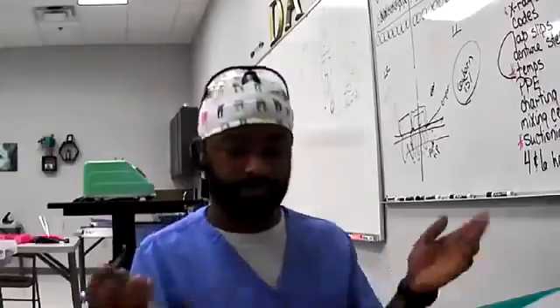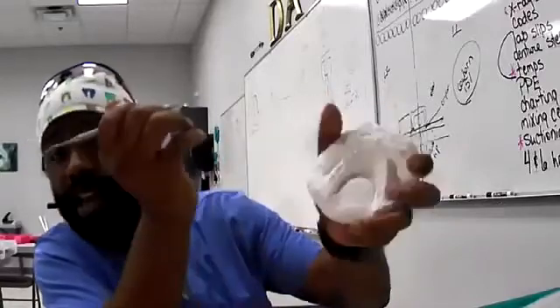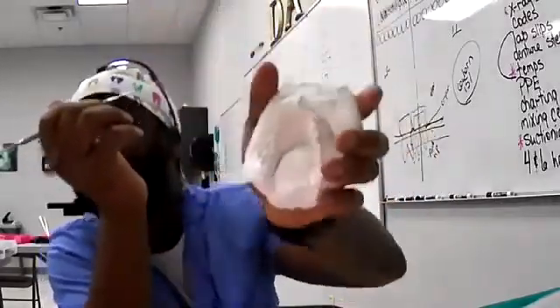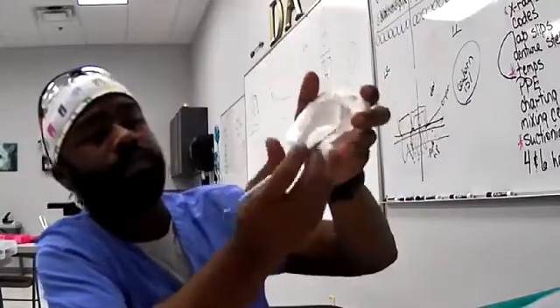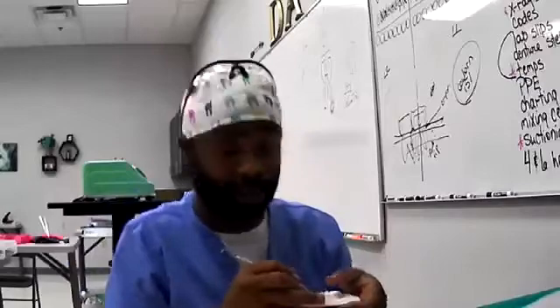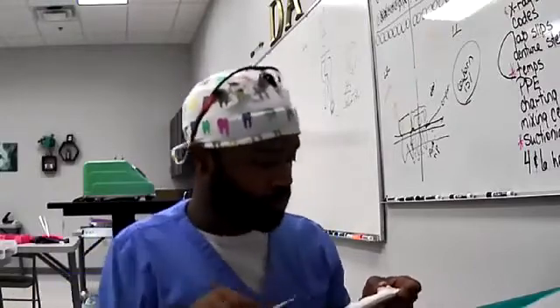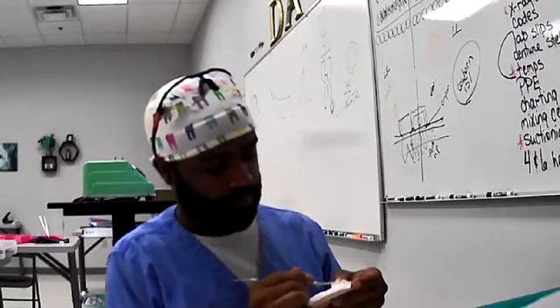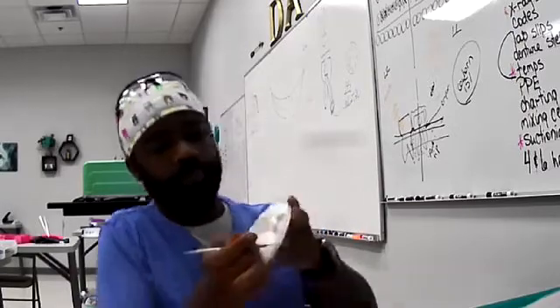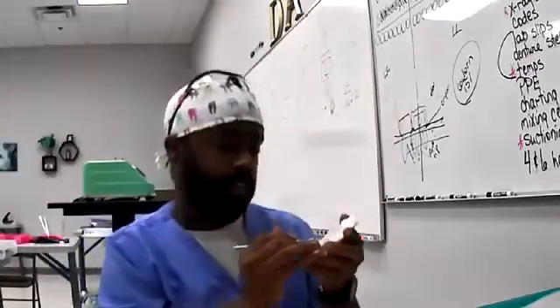Okay, but same thing. Let's say it's the back tooth. We've already taken the decay out. We've already put the Dycal in it. Let's pretend we put a matrix band on it. I can't because it's stone. I don't have a spot to put it. But once the matrix band is on, same thing. You would go in and literally pack it in that tooth. Let me get the instrument for this. I think these two do. Okay. So you pack it as good as you can.